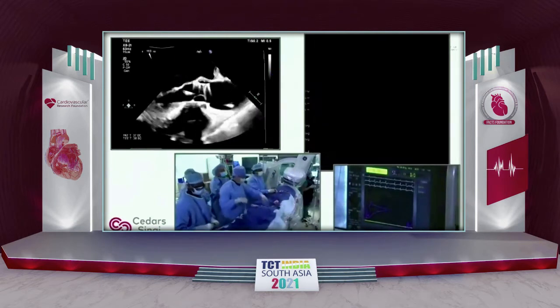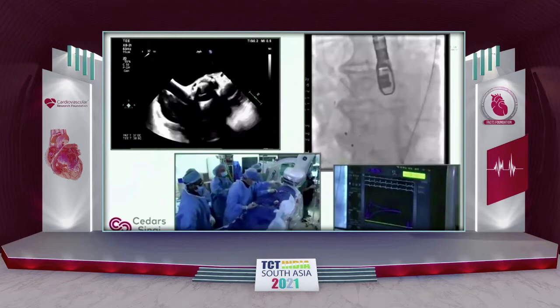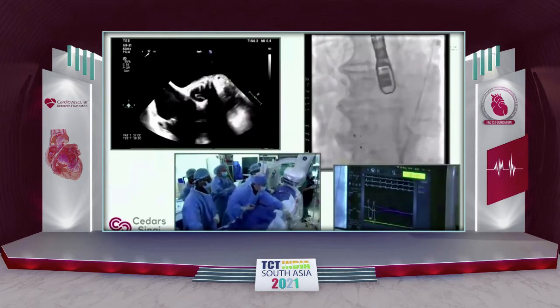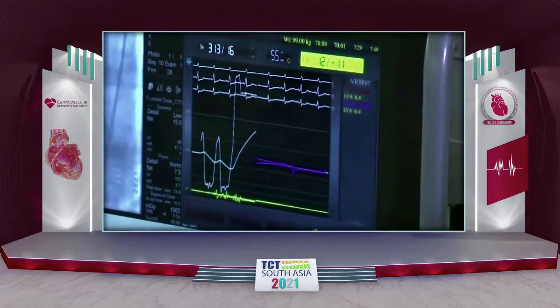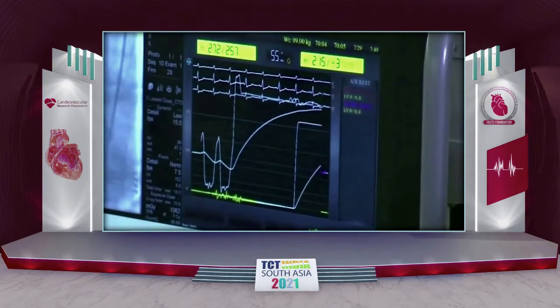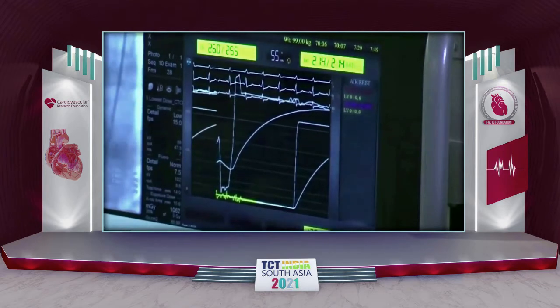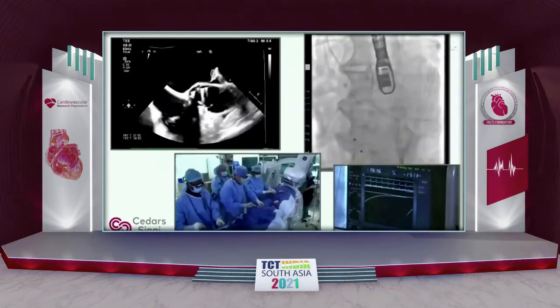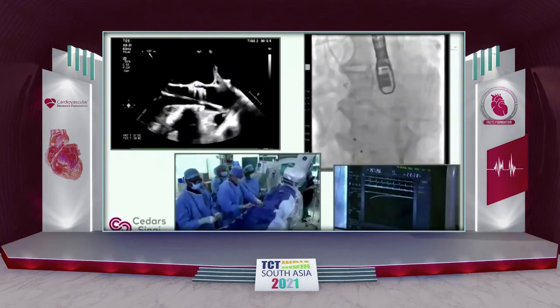It took the person 80 years to get onto your table. Maybe you can spend 8 minutes doing it right by measuring the gradient. Yeah. Okay, so here, I think, these hemodynamic tracings make for a good case. When you send these tracings to your referring doctors, they like seeing those, and it's helpful.